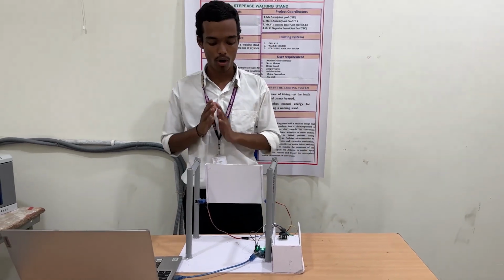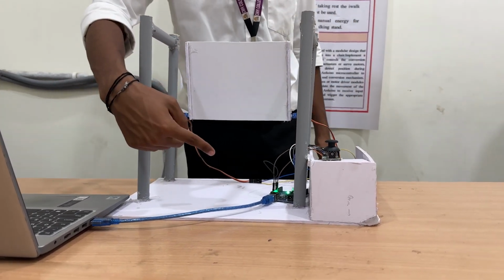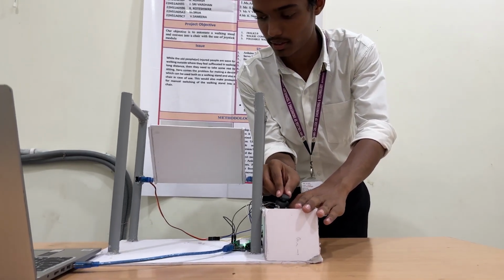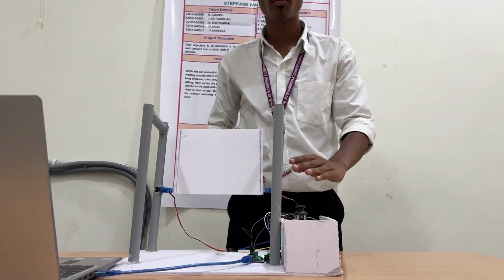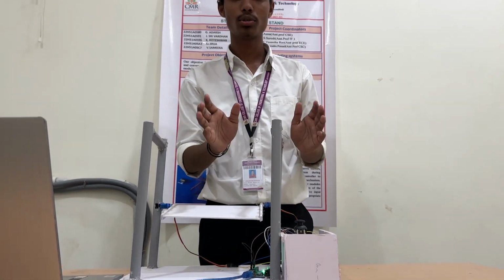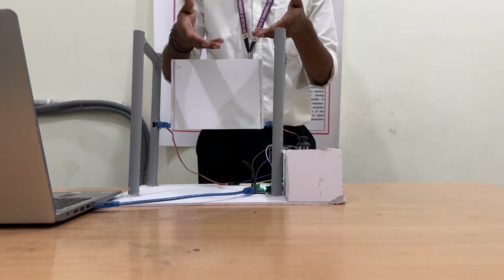Now we'll explain how our project works. Here you find the joystick, and here the Arduino cable, and by this Arduino cable you insert the code into the Arduino. Then you see how it works by use of the joystick. It is a to and fro motion. When it is moved down, it is useful for a person to sit for some time to take rest, and then after that you can close it by using the same joystick. Then it is again used as a walking stand.